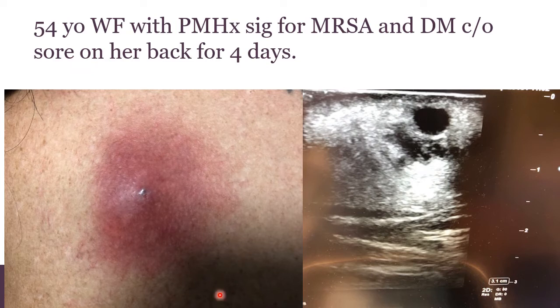And you know, MRSA is the scourge of the earth. I don't have to tell you that. I hate this stuff, and I especially hate these types of MRSA infections. So when you feel this lady, it's hard, it's indurated, you don't know if there's pus underneath there, if it's coalesced yet or not. And so I'm about 50-50 on these. Sometimes I'll cut them open and there's pus there, and sometimes I cut somebody open and there's no pus there. But here's the ultrasound I did on this person, which proves that she actually has a coalesced abscess.